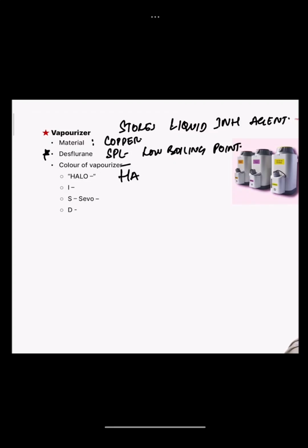Halothane, what is the color coding? Remember, guys, halothane, when you write it, I used to remember halothane means it is like hellfire, which is red in color. So halothane vaporizer will be red in color. Isoflurane, it is purple in color.